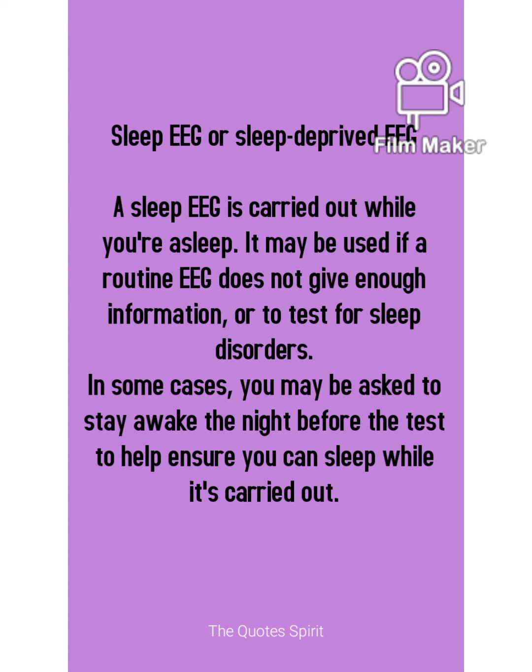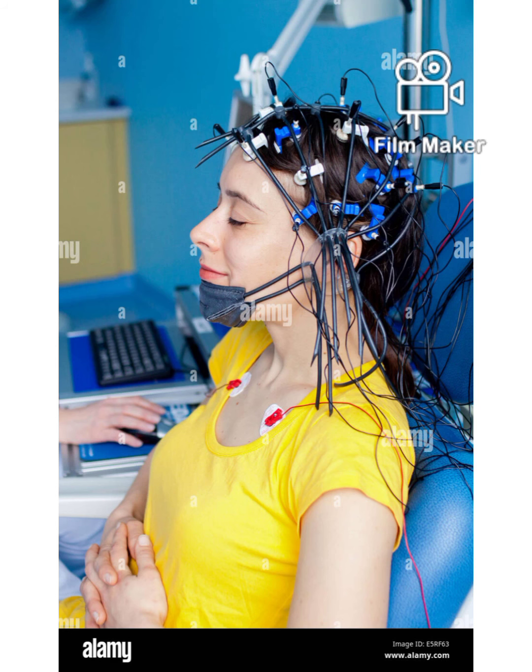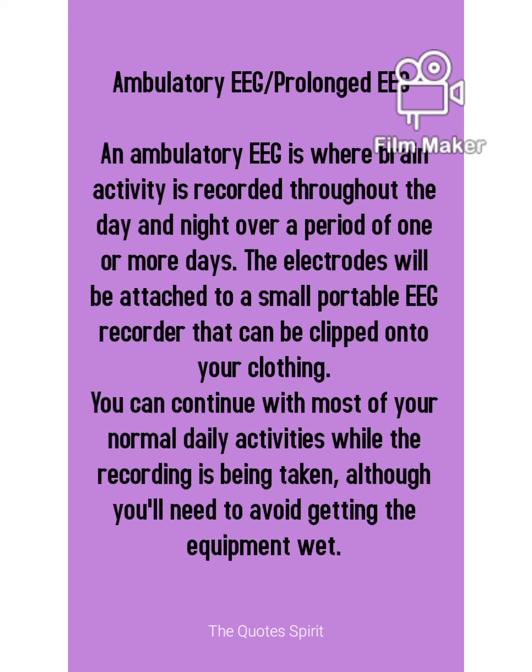A sleep EEG is carried out while you are asleep. It is used for sleep disorders, and this test will be done only when you are asleep, not when you are awake, and only at night time. In some cases, you may be asked to stay awake the night before this test to help ensure that you can surely sleep when the test is going on.